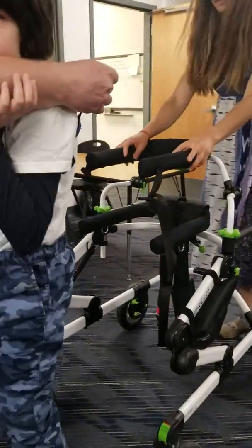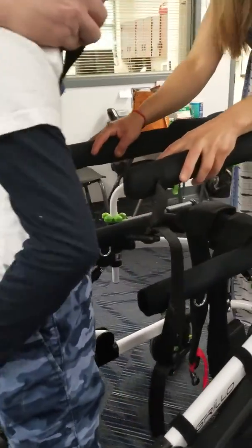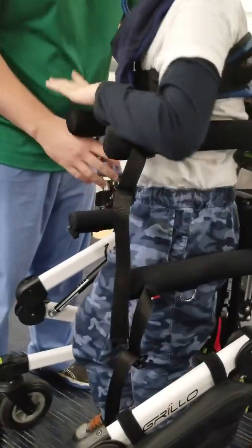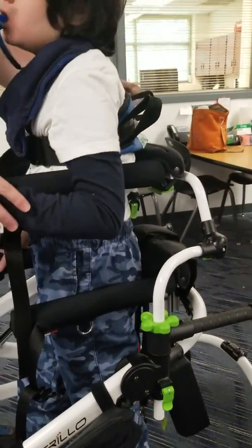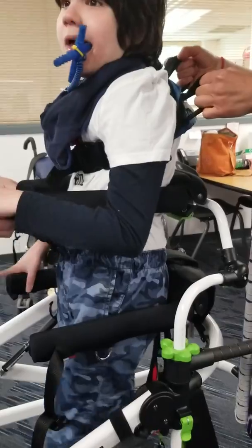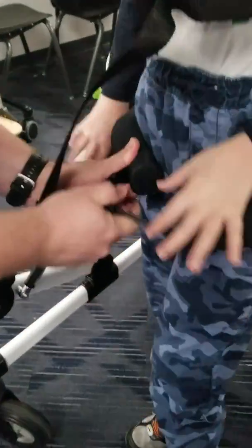So we found that it's easier to bring the horse stationary and pull it up to him. Yeah, it seems easier because sometimes the backing up just depends on the day. So I'm sorry, is the pommel not up when you bring him in? Put it up. I'm just checking if, when you wheel it in, the pommel is already there for him, that's all. Now I just kind of work my way down.